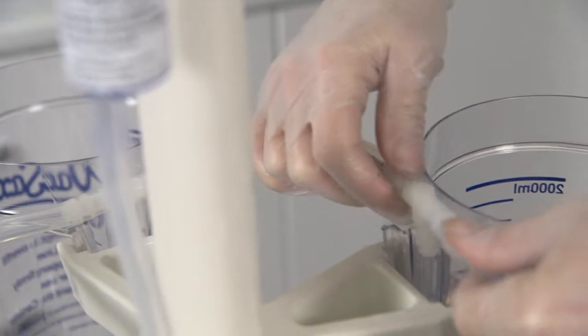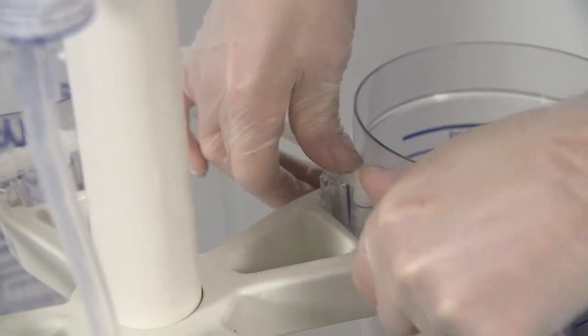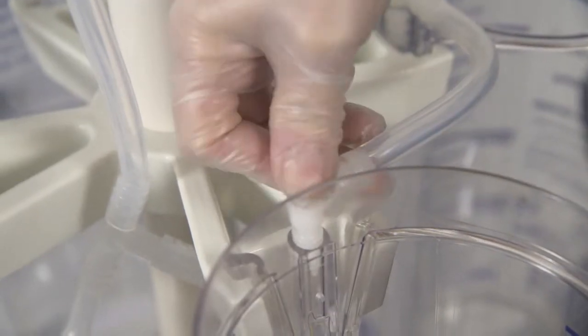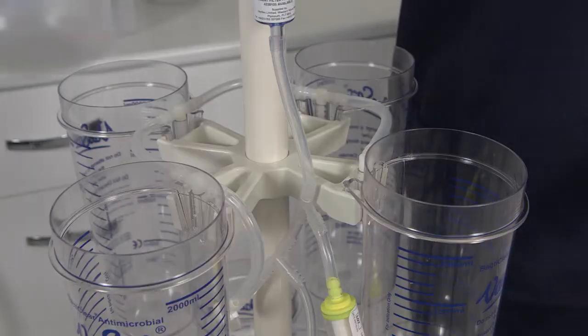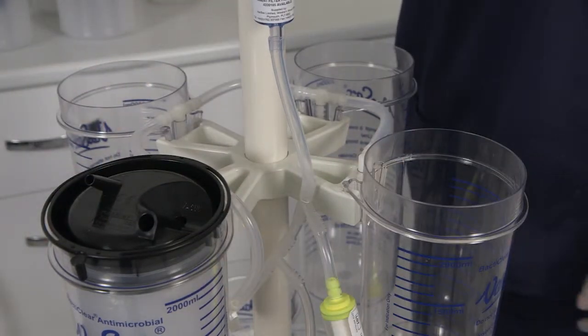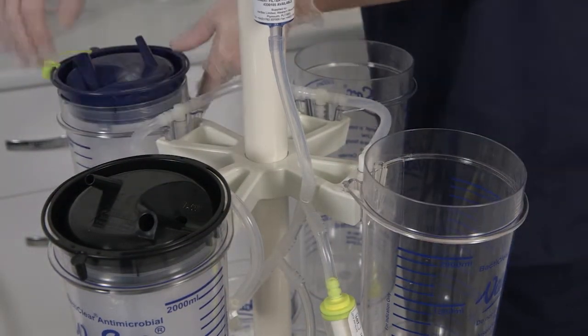Attach the remaining 4 connectors into the back of the bottom row of canisters. The first liner to be put in position is the black lid standard liner, which is placed to the left of the suction controller.